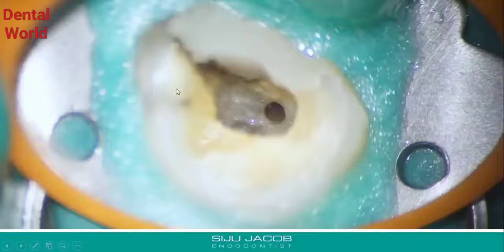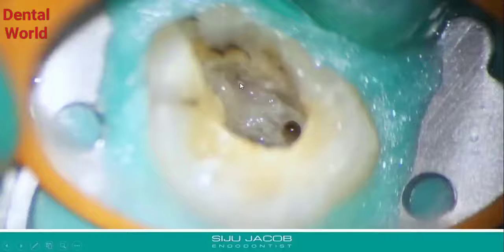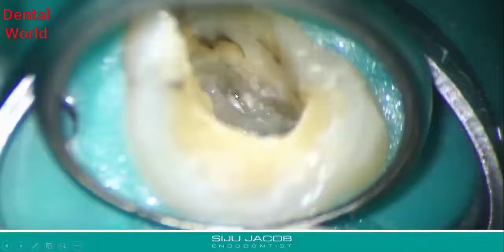You can see a bit of secondary decay there as well. So we start cleaning up this area, and then we found the mesio. You can see the characteristic white spot here that tells you that it's calcified. So once you see a white spot like that, then we take a small Muntz burr and then precisely drill out this white spot, and sure enough, that's where the canal is.